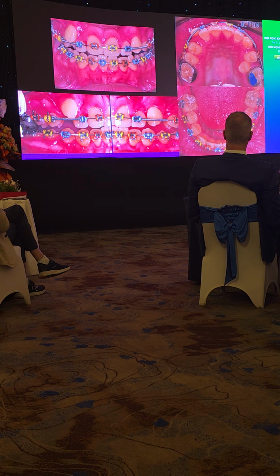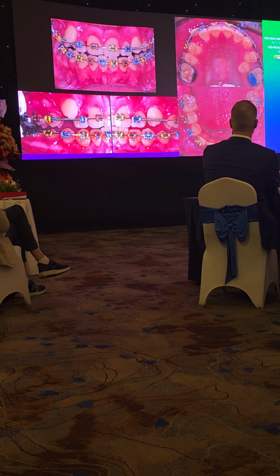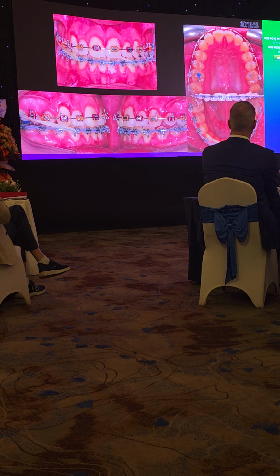And you're going to see, students over there, if there is enough room for accommodating the 2 canines and the premolar at the back there, okay? So it turns out, okay, that we were successful as far as getting enough space.